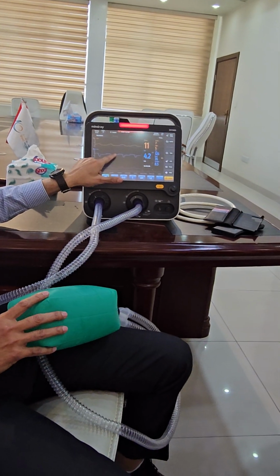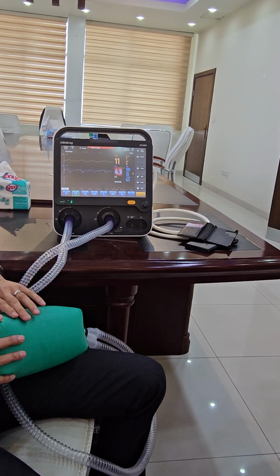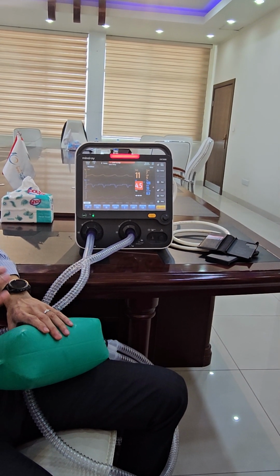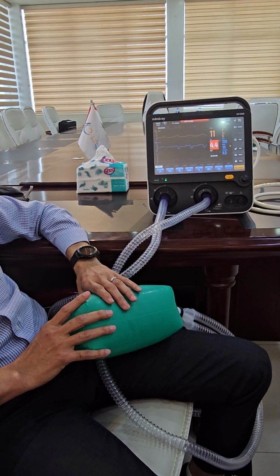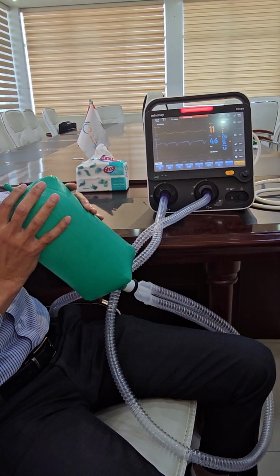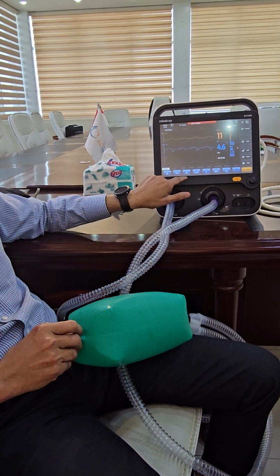Okay, you see the difference? So if you see the wave, this is what? Plateau. This is volume, because volume has a plateau. It takes time of flow, time for the flow to build the volume. While if it's pressure, it's the speed of the flow. If you want to blow a paper, it's quick, but if you want to blow a balloon, you need time. So let's move to pressure.